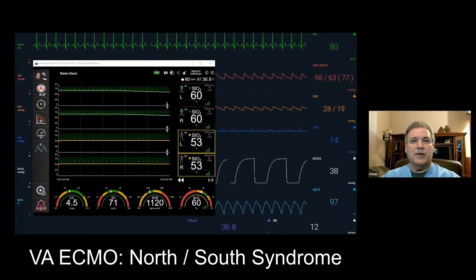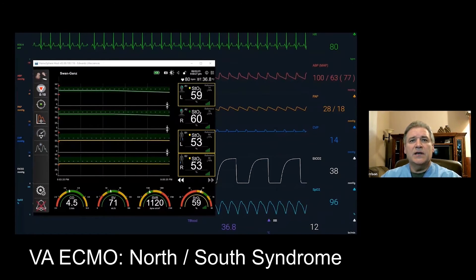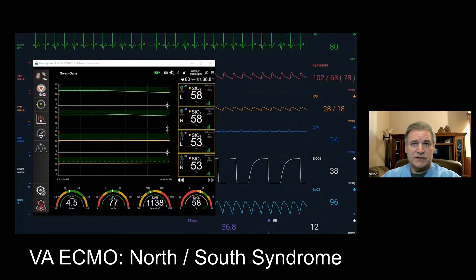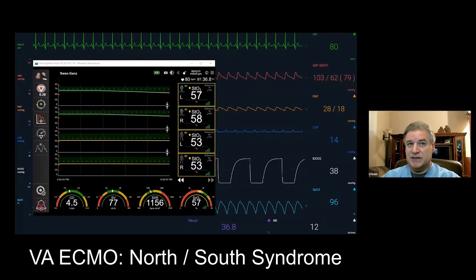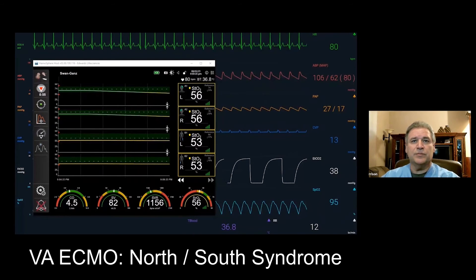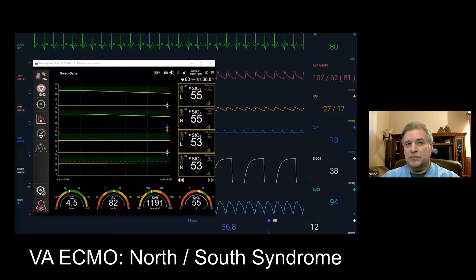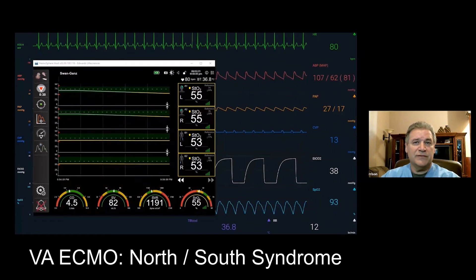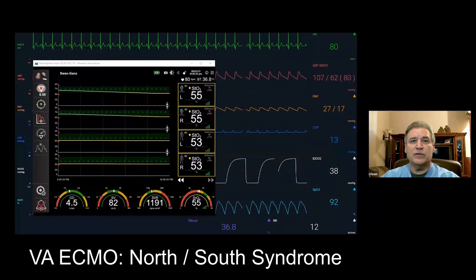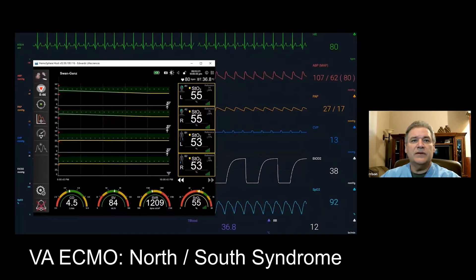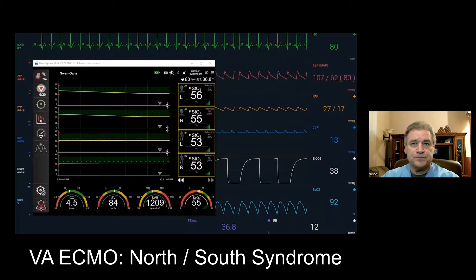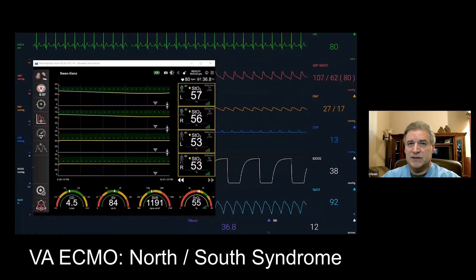Manifestations of this phenomenon may include one or more of the following: a decrease of SpO2, reduced ScVO2 and/or SVO2 values, the presence of or increase in arterial and pulse pressure waveforms, a decrease in pulmonary wedge pressure due to an increased left ventricular ejection fraction, as well as a decrease in the values of the cerebral saturations. However, given the appropriate intervention as provided and what you can see just took place on the screen, the incidence of cerebral ischemic event can be mitigated.